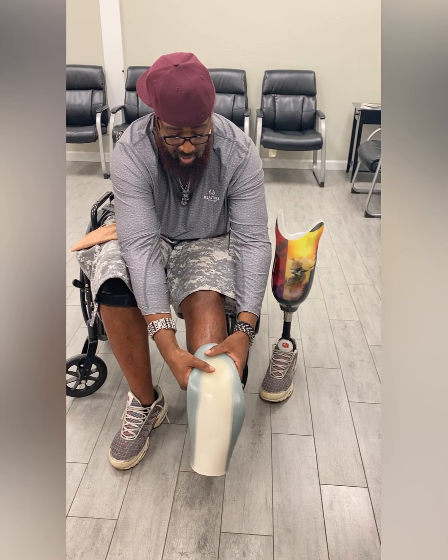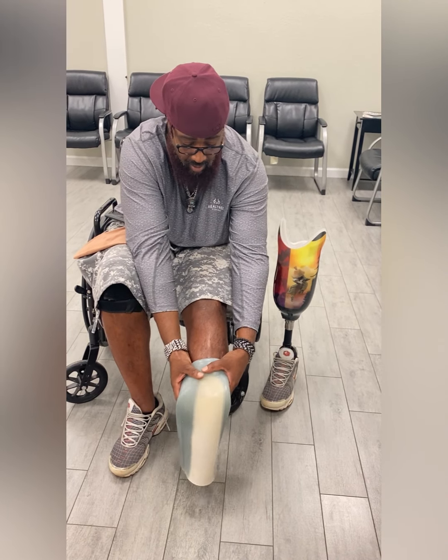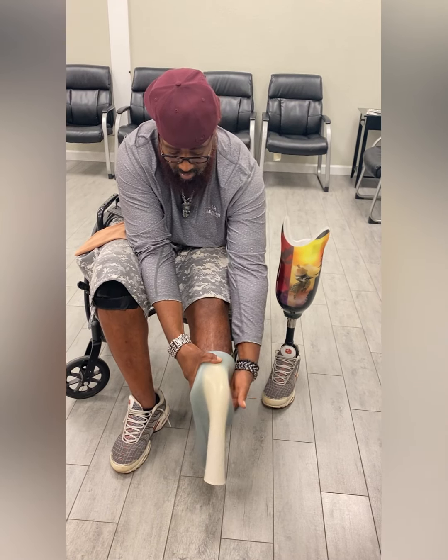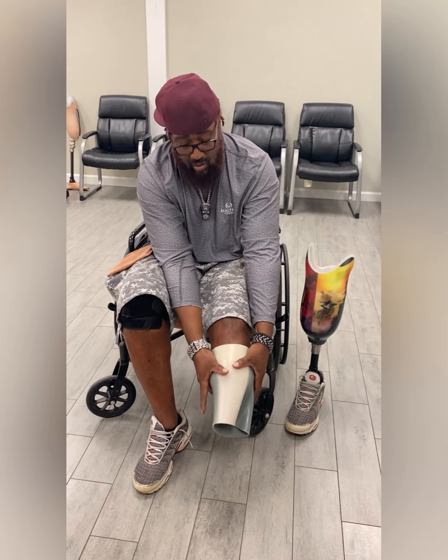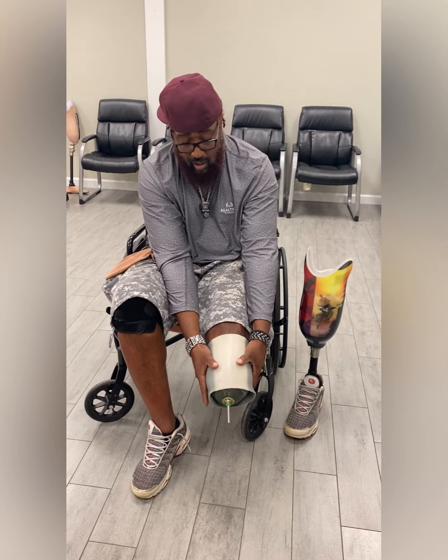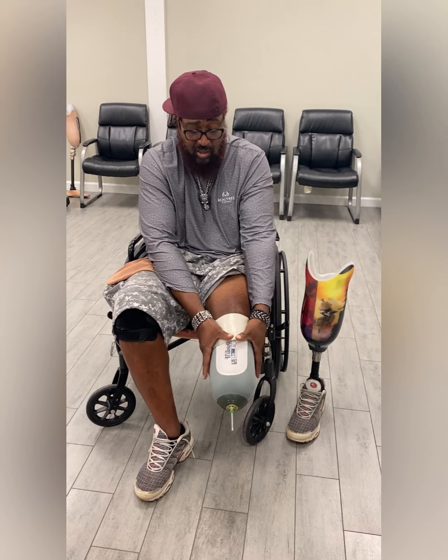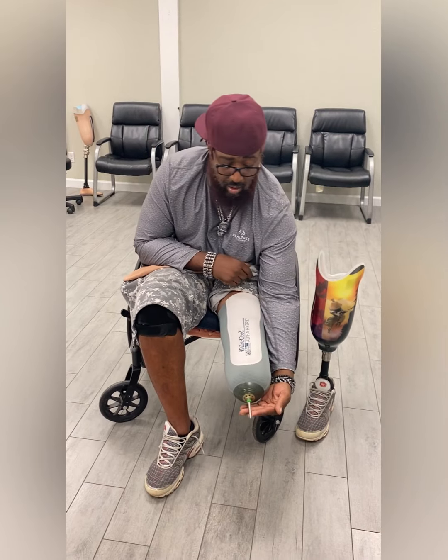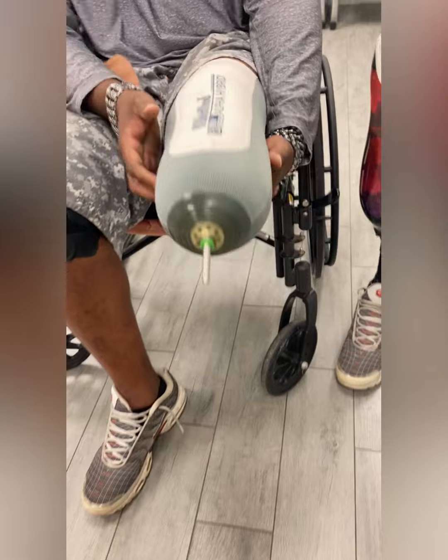Push the liner tight on the bottom of your limb to get out all air pockets. Use your palms to help roll the liner on smooth with no wrinkles. Make sure the pin orientation looks correct before donning.